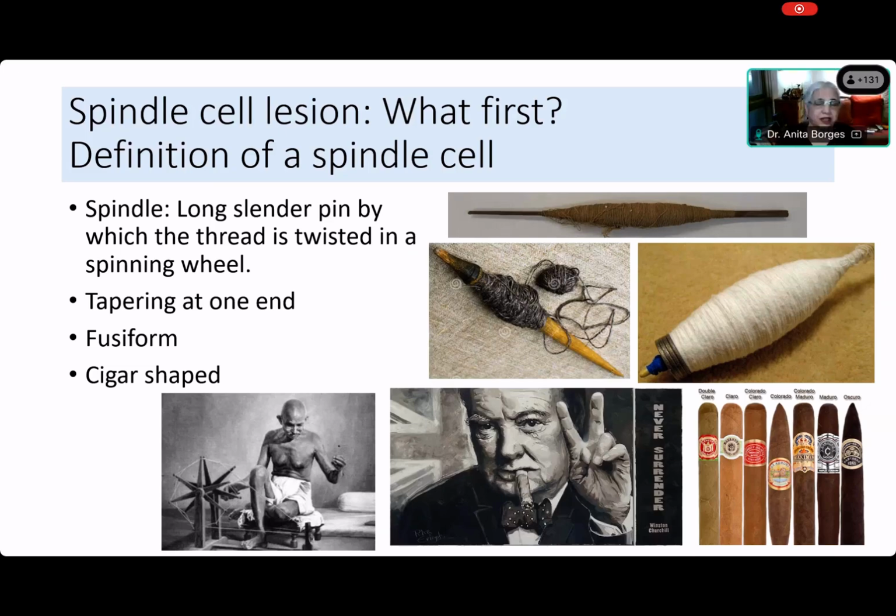Oh, so the spindle cell is defined by the color of its cytoplasm. Is that right, Aditi? No, ma'am, I repeated what Diksha said. Did she say moderately eosinophilic cytoplasm? I didn't hear that. I thought she said moderate amount of cytoplasm. But what do you think? Okay, you repeated what she said, but please tell me, what do you think? Moderate to scant amount of cytoplasm. Okay, so according to you, the cytoplasm defines a spindle cell.